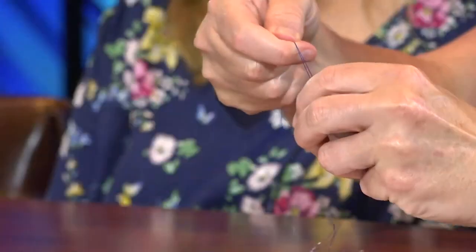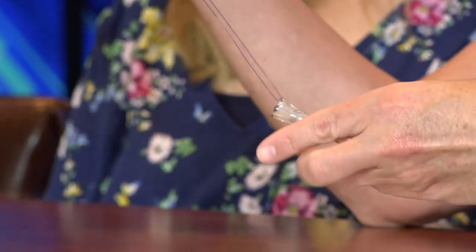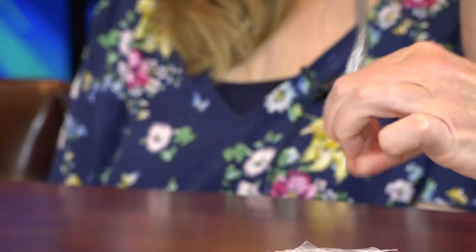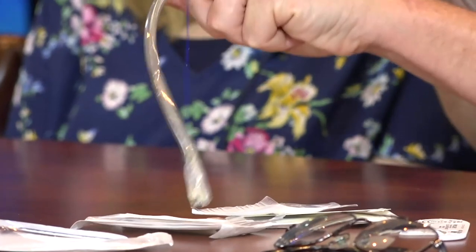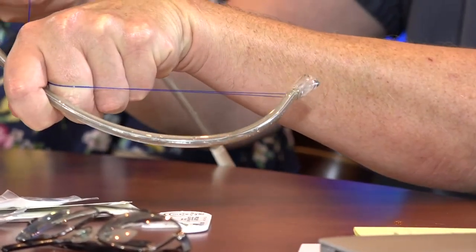And so if you figure that you're going to have to use this, you'll have to take it back out and then reinsert the catheter back into the dry sheath. So it goes back in the dry sheath with this beside it, and you're holding on to the strings. And so when you go in, you're up here in the neck, you can make the catheter go up and out the pulmonary outflow tract.